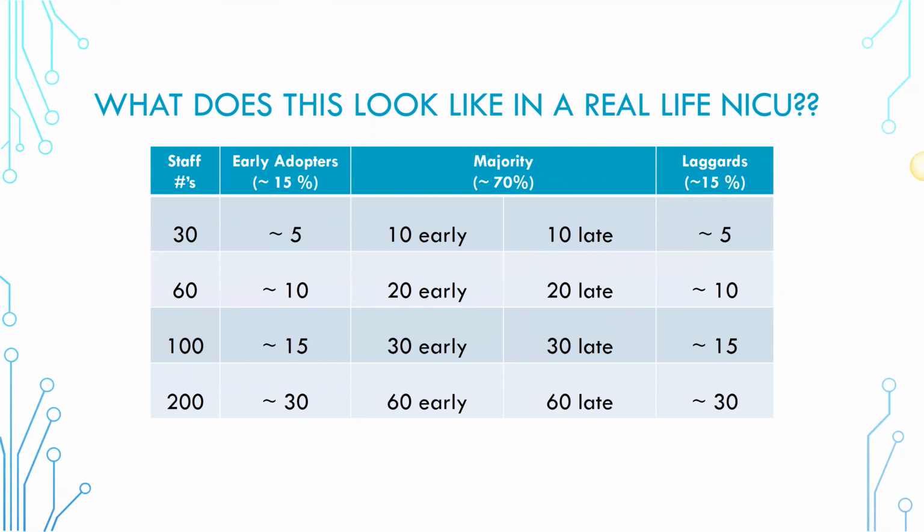Depending on what your protocol is, just looking and seeing if there's variance. And then maybe you could track your utilization of neuroconsults, how many video EEGs you're getting, what are the lengths of the video studies. I mean, there are all sorts of ways to look at your program and to then think about whether or not it's really the best that you can be.